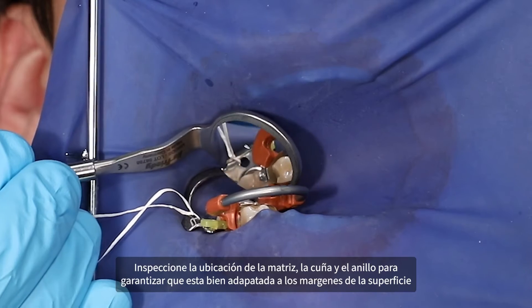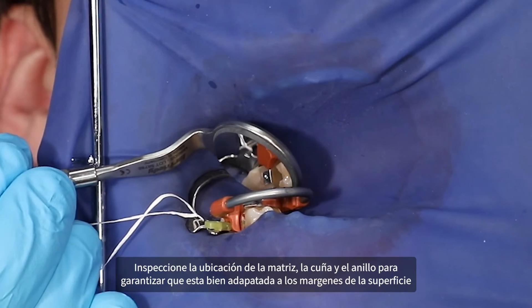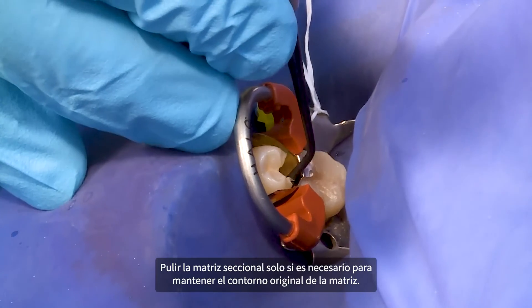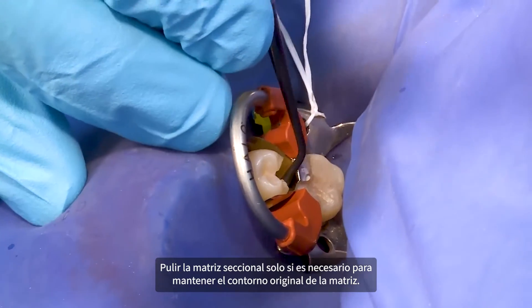Inspect matrix, wedge, and ring placement to ensure that the matrix is well adapted to the cervical surface margins and that the matrix is in intimate contact with the adjacent tooth. Please note: burnish the sectional matrix only if it is necessary to maintain the original contour of the matrix.